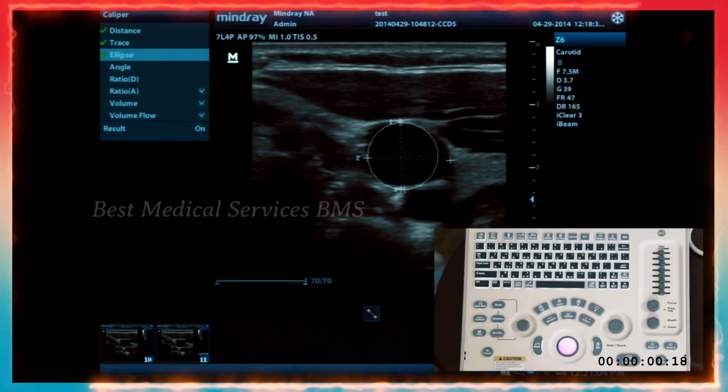You can annotate either by free typing directly on the screen or by going through the ABC comment key — both engage the annotation mode the same way.